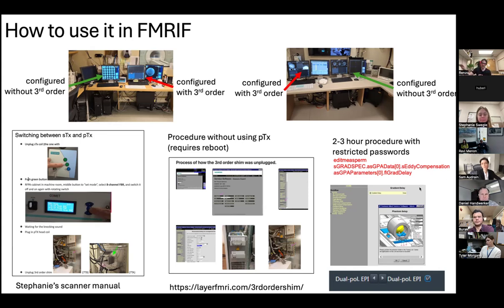You need to do a kind of consistency, temporal stability check, which usually comes down to 2-3 hours of retuning features that depend on these short-term eddy current compensations. So I don't advise anybody to play with this just yet. It also requires yet another password that's a bit harder to get. So if you want to use Epic, I would propose to rather use the dual polarity approach that accounts for these short-term eddy currents just as well.